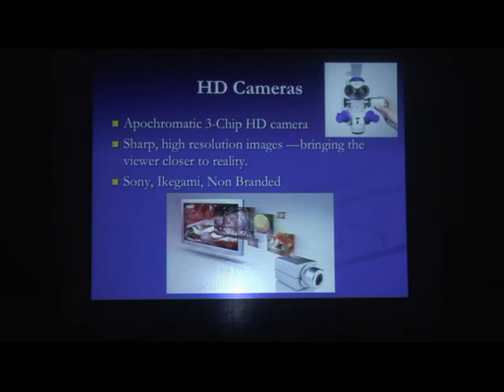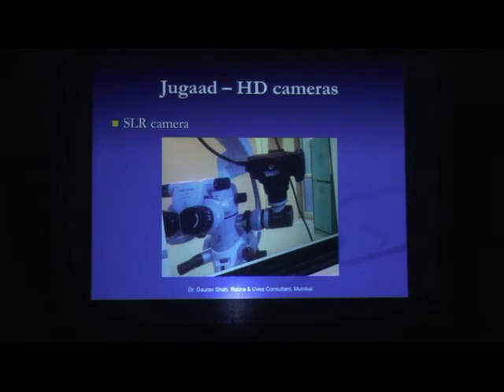The non-branded one would be a high definition 3 chip digital camera, which you can directly mount onto the beam splitter and C-mount of your surgical microscope.